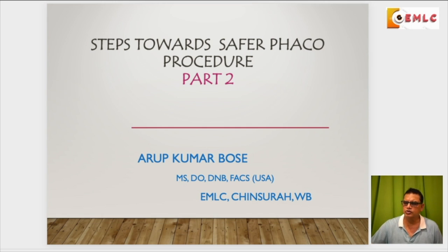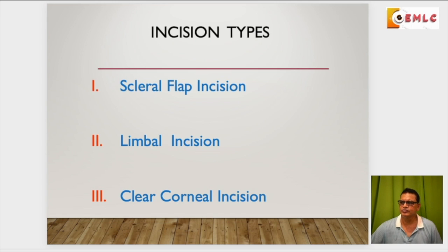Today we are going to talk about something about the technique. So let me start with the incision. When we are doing a phaco surgery, it's different from what you have been doing for SICS.